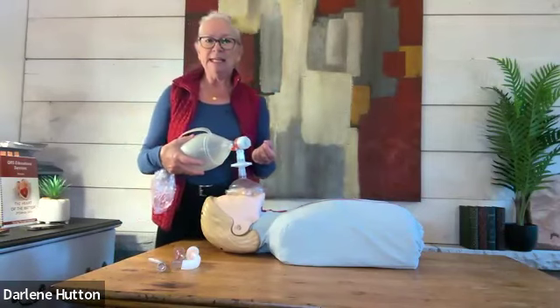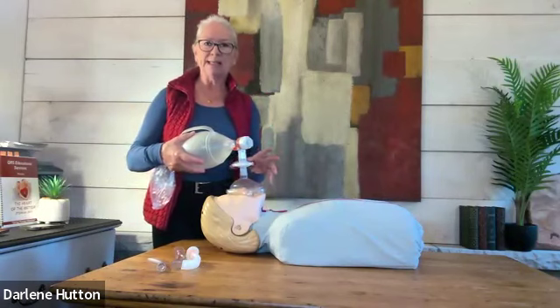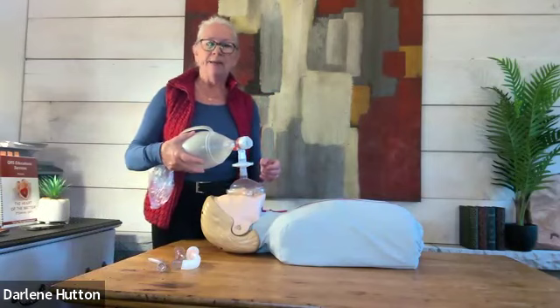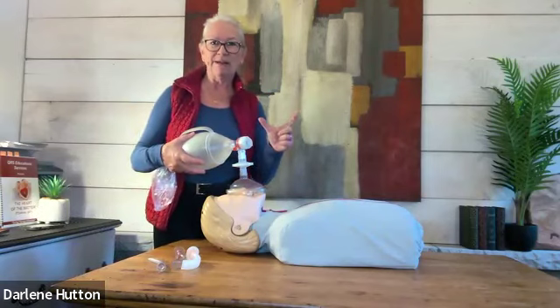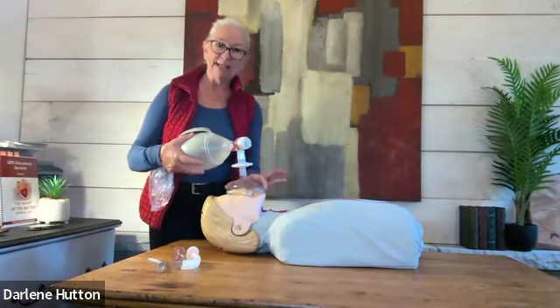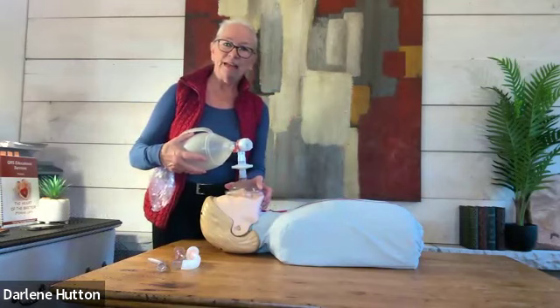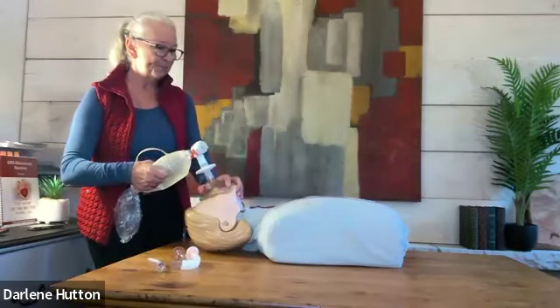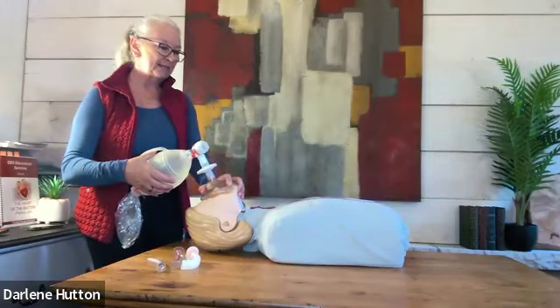You can use this right-handed or left-handed, whatever your dominant hand is. There are a couple of techniques that work very well at making sure that this mask has a good seal so that there is no leakage of air. The most common technique is called the C technique, where I take my finger and my thumb, place it on the mask, and I take my remaining three fingers and put them under the jaw. I do a head tilt chin lift, and then I would give a breath every 6 seconds.